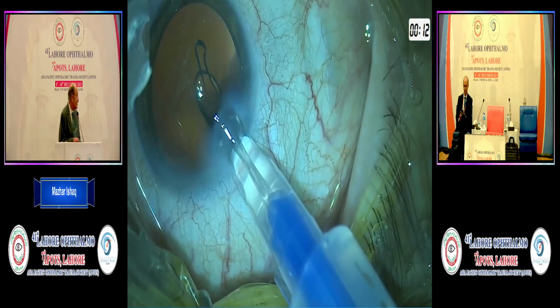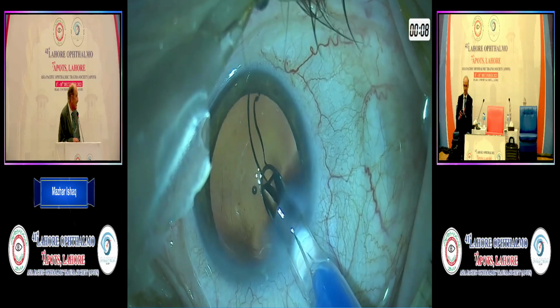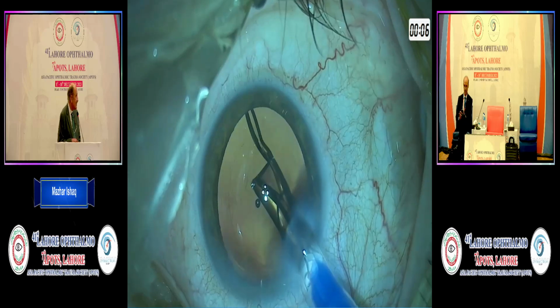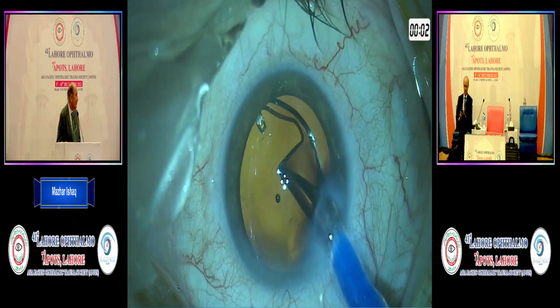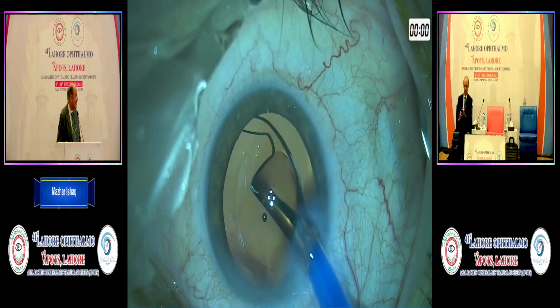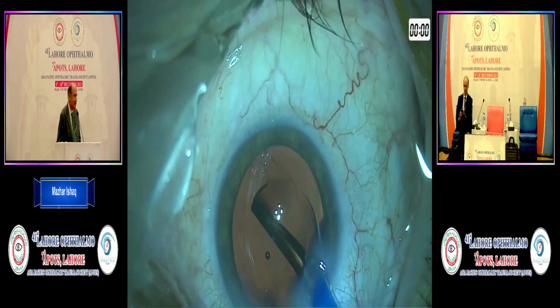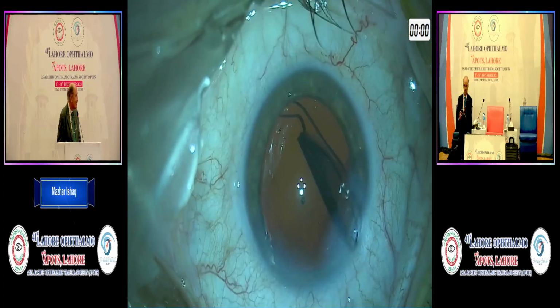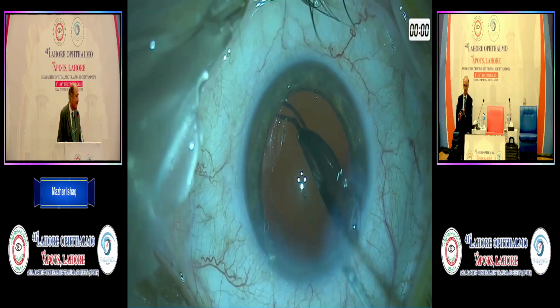You have to be very slow, because it is a bit hard or rigid until it goes in. So what it needs is a bit of warmth before it goes in. As Professor Al-Mazri was saying, warm, garam, so something has to be done before we put the lens in. Otherwise I don't think there's anything specific about it.